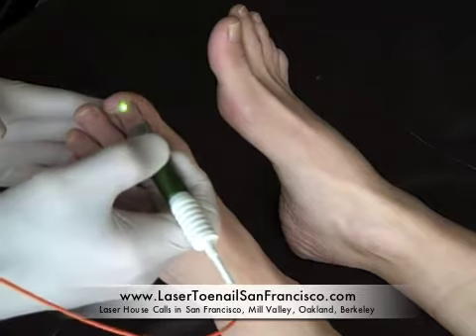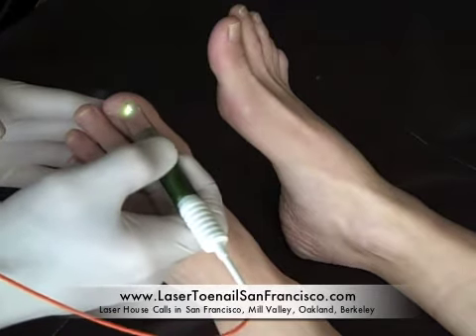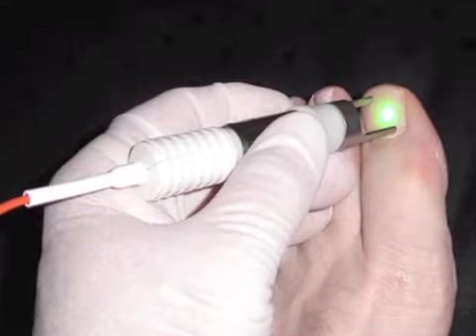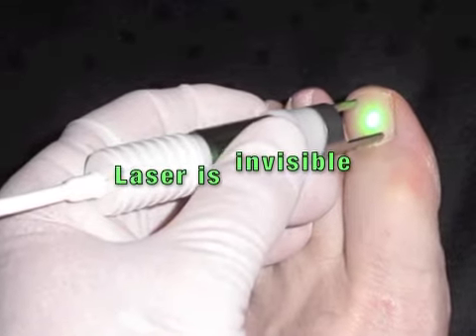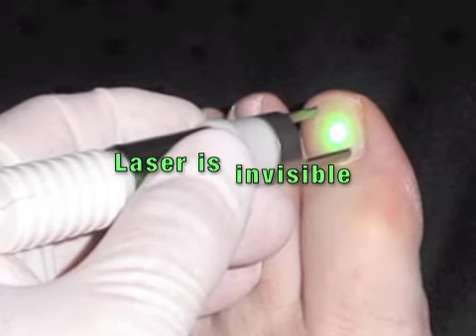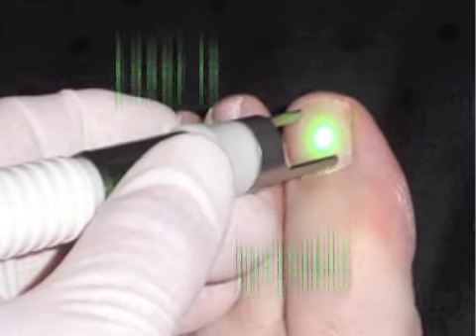The laser treatment is non-invasive and it is not painful. Patients typically only feel a slight amount of heat in the toenails during the procedure. The laser beam itself is invisible. What you actually see is an aiming light, which helps the podiatrist make certain that all areas of the toenail are treated with the laser.